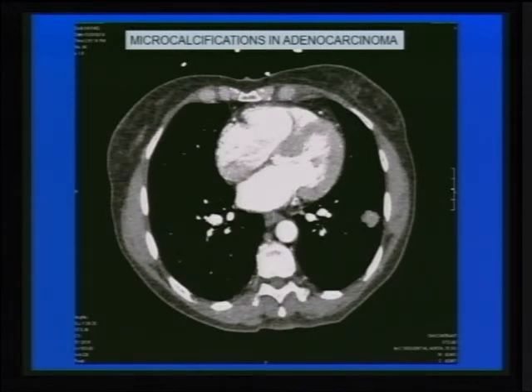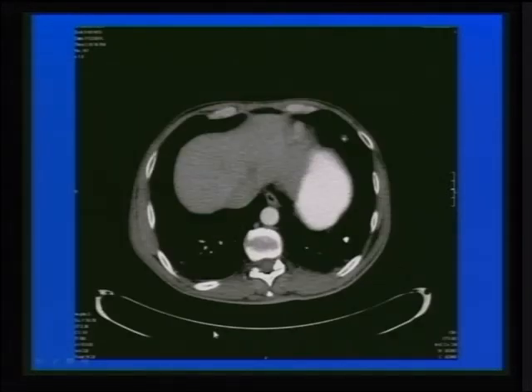Now, I do have very few cases of cancers with microcalcification, and this is a patient with an adenocarcinoma with a psammomatous but very fine stippled calcification. And you can also look at the contour of the lesion. This is more suspicious of a cancer, not just the presence of calcification. So the point is that calcification doesn't mean always benign disease.